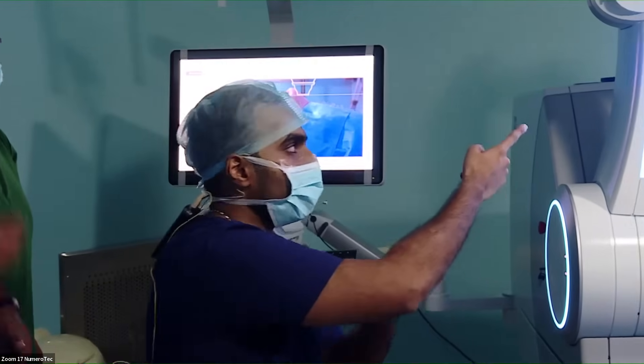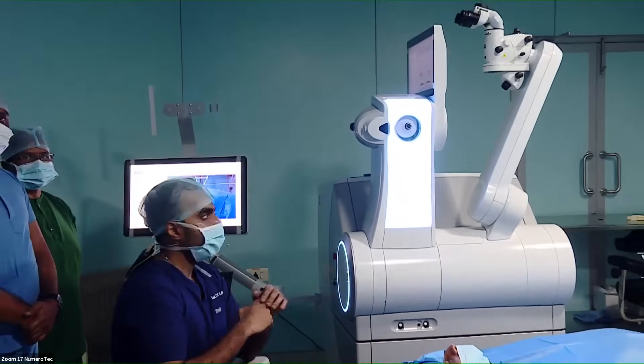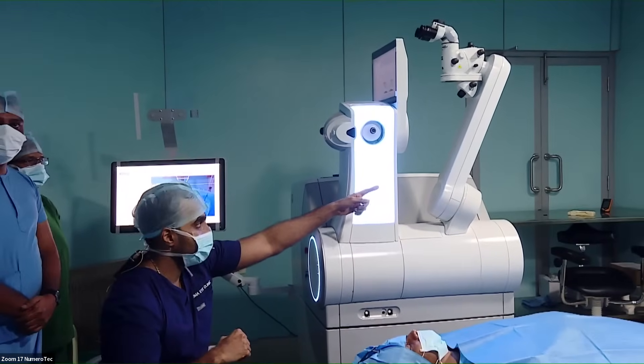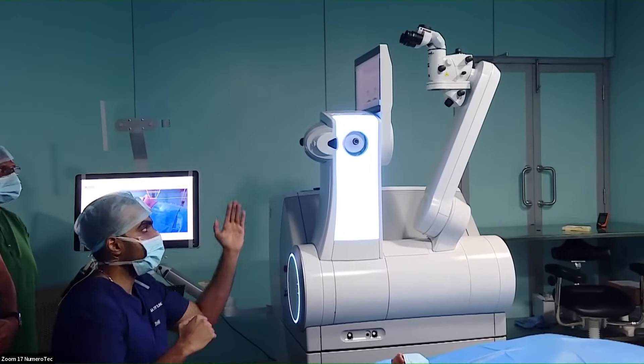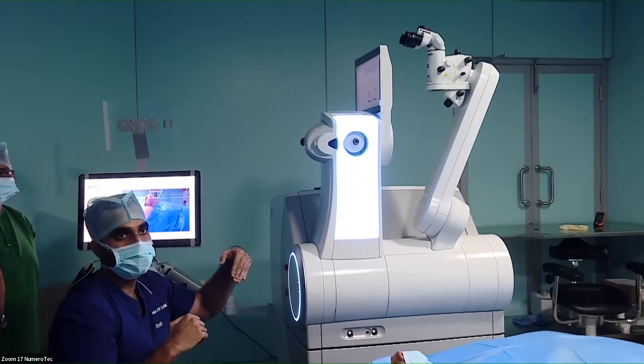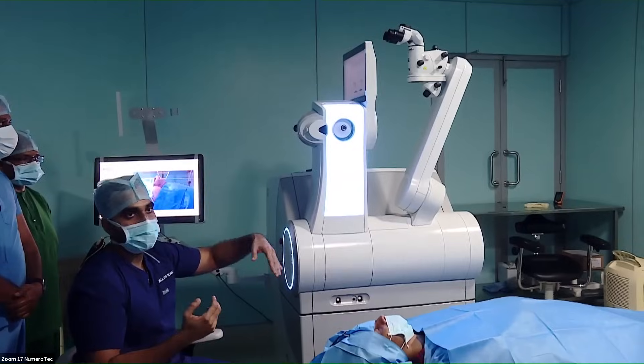You can also enter your power settings required for the procedure. Here we have the two arms of the machine. The one with the blue light is the laser arm, and the other arm is the microscope arm. Each arm will swing up and down for each step of the procedure.